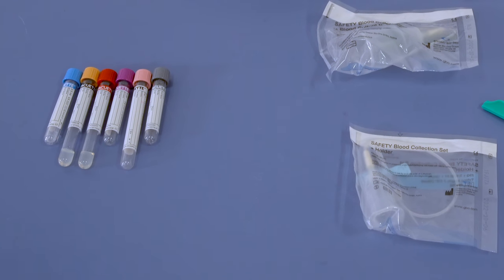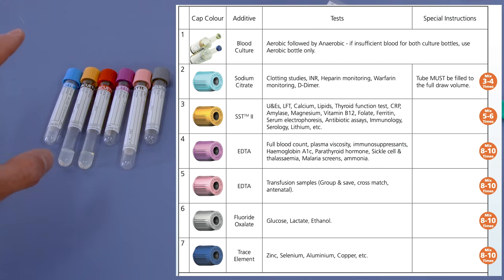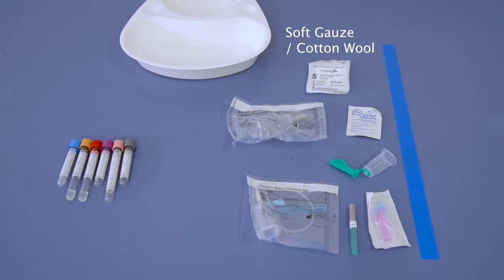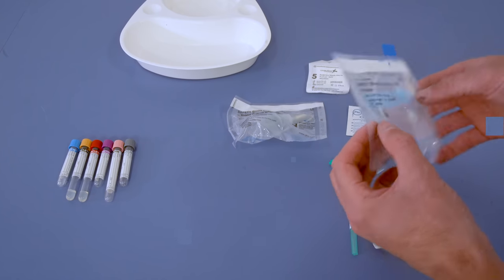Before we actually go and start doing the procedure with the patient, we need to make sure we've got our kit ready. We want to know which blood bottles we're going to be taking and, crucially, make sure we know the order of the bottles. This is quite important because of the nature of the chemicals in the bottles, and to make sure we've got the highest priority bloods sorted in case there's a problem with the vein. Different hospitals will have different sets and different ways of doing it, so there may be slight variations.